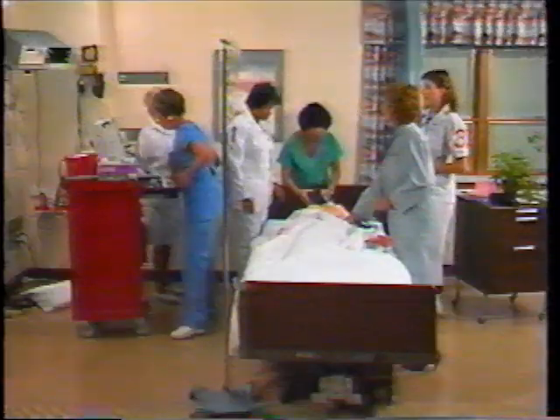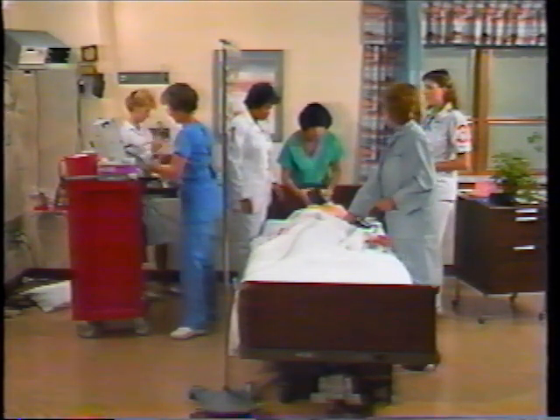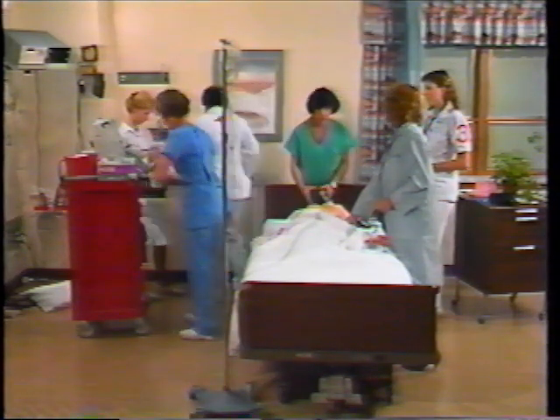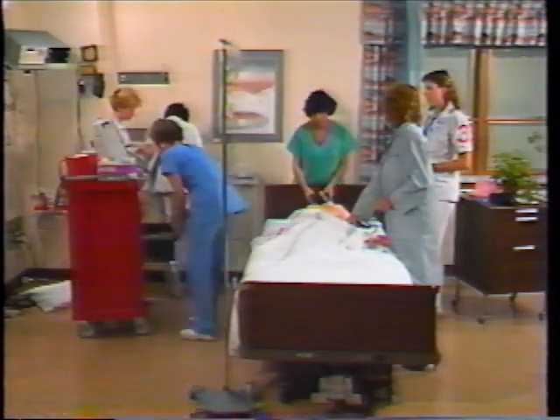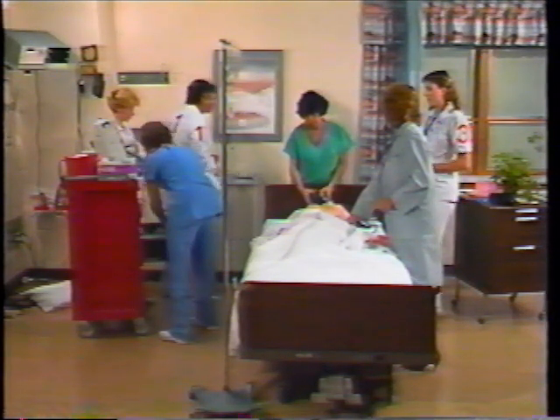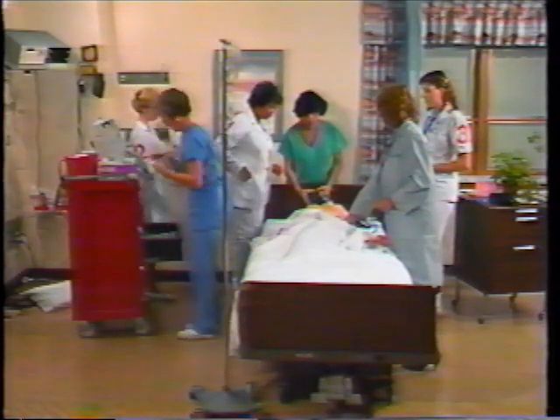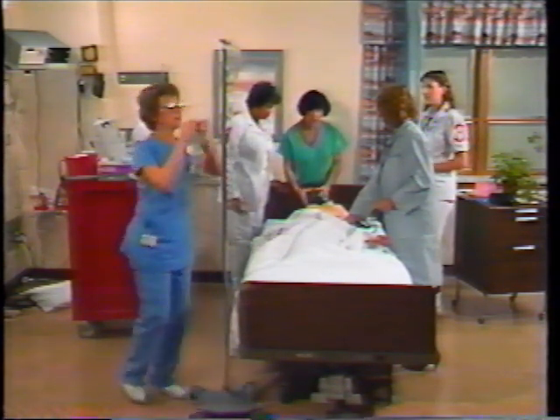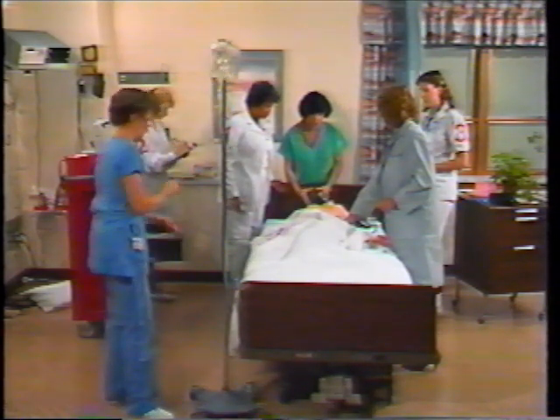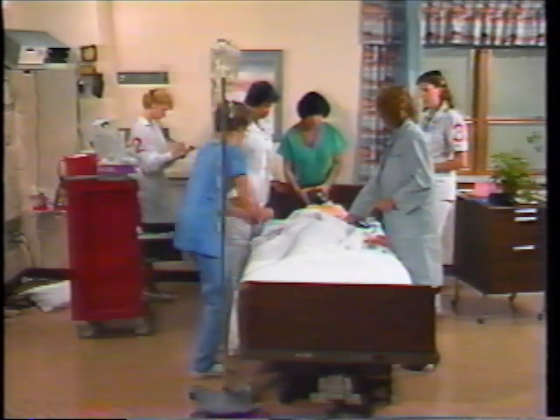400 milligrams and 250 D5W. The physician orders 400 milligrams of dopamine and 250 cc's of dextrose and water to be started at a rate of 5 micrograms per kilogram per minute. Nurse number 1 checks the chart for the patient's weight, which is 50 kilograms. 400 milligrams of dopamine and 250 D5W. Again, be aware of the direct line of communication between nurse number 2 and the ICU nurse.